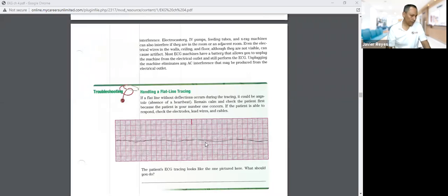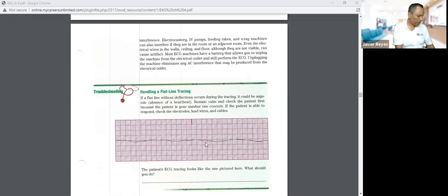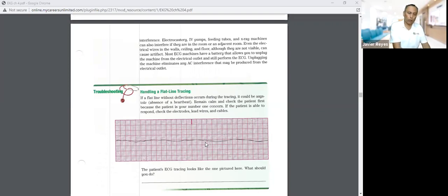Flat line tracing. The speed. Or somatic tremors. I don't think I spoke about somatic tremors. Soma means body. So body tremors. If the person is cold, shivering, or nervous, that's going to give you very fine little black linings, and we don't want that. If you see the person shaking, obviously they need to be kept warm. Maybe put a blanket on them. Especially if you're going to undress their top part, they're going to be cold. So we have to handle that with caution.